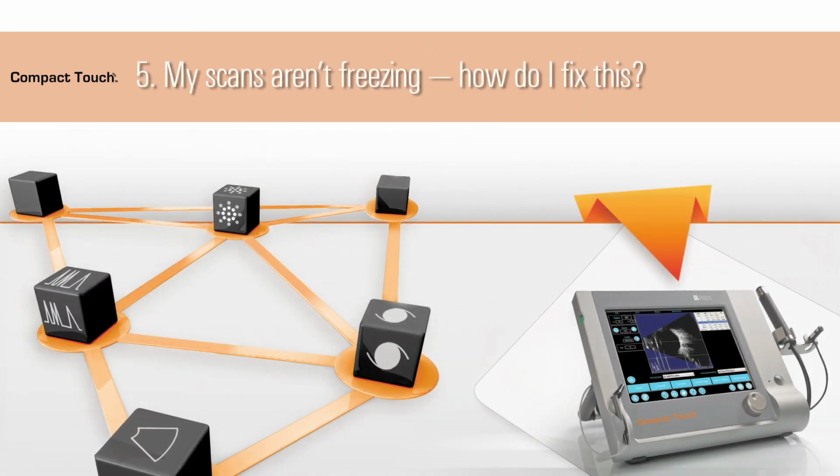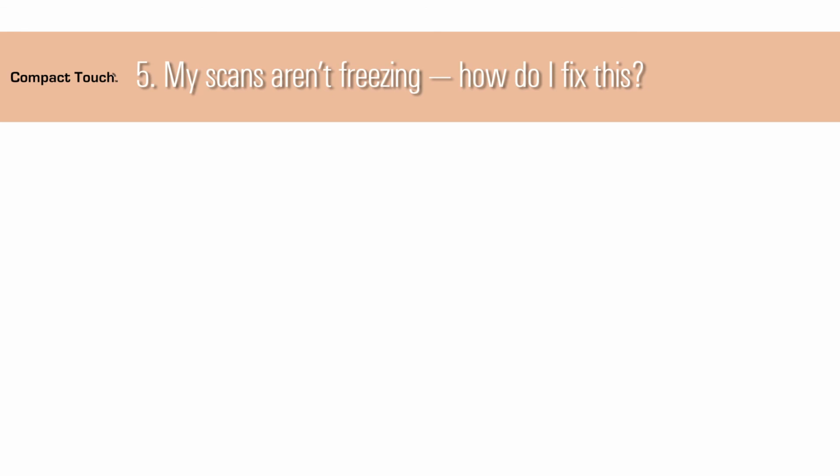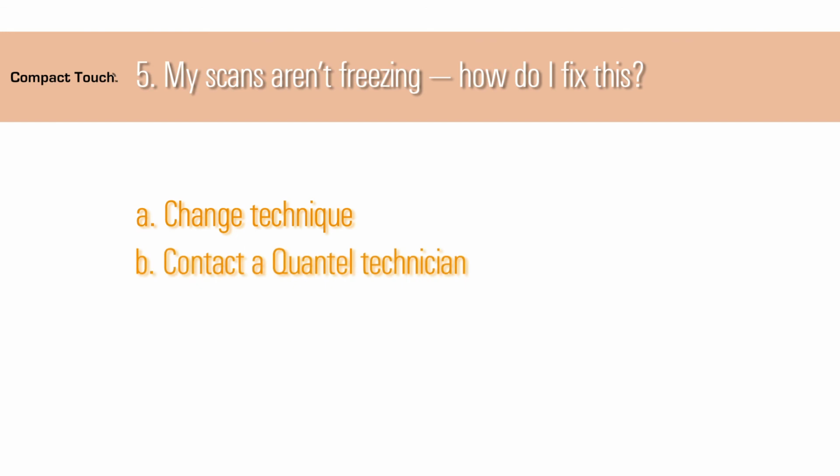5. My scans aren't freezing. How do I fix this? If this is happening infrequently, it's probably not a technical issue and has more to do with technique or probe positioning. Ensure that the technique settings are correct, contact versus immersion, and gain is normal. If this happens with all patients, it is more likely a technical issue. In this case, please contact a Quantel technician.